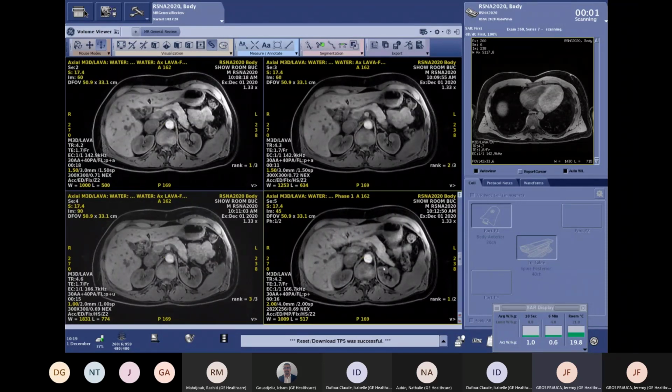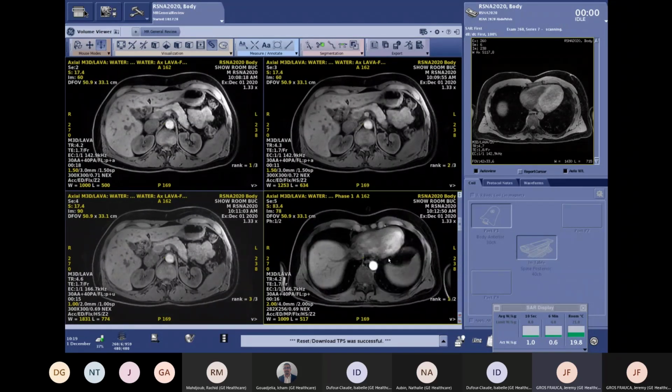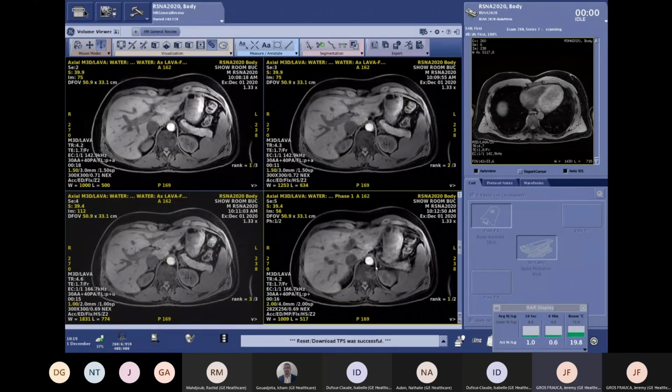And here we have the same acquisition with 2-time covering, so a multi-arterial approach. Here you have 1 time and here another one. You can see that by using Hypersense, we maintain the image quality without any penalty in terms of breath hold time for our patients.